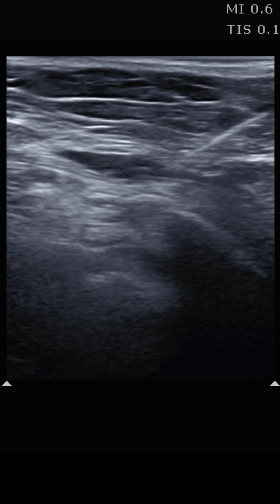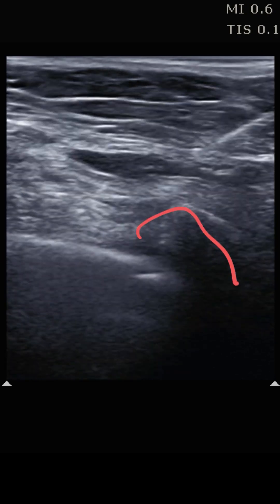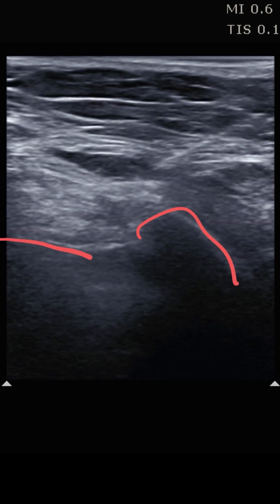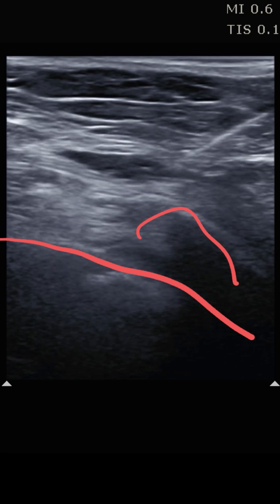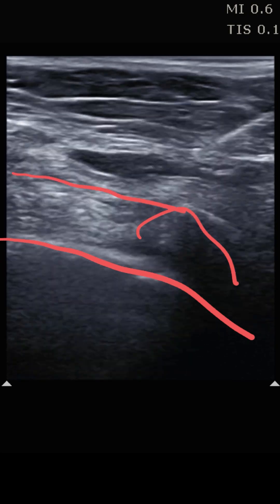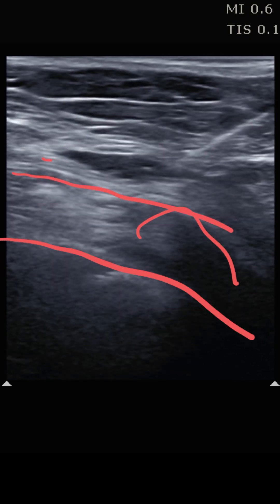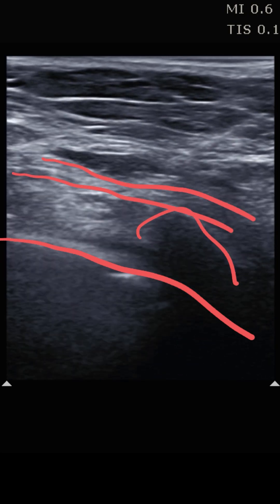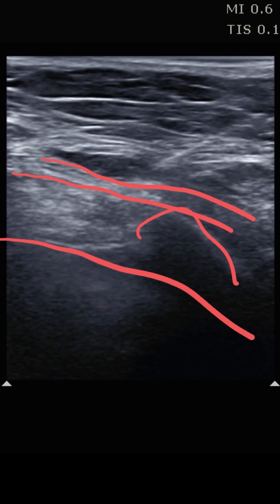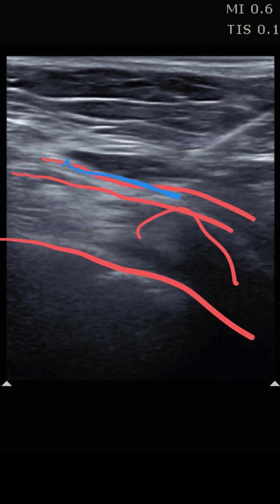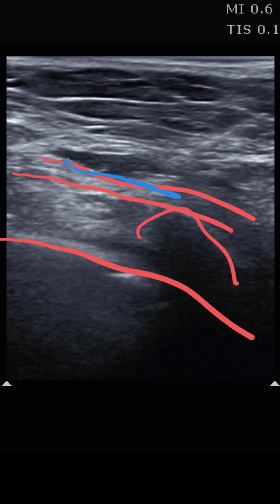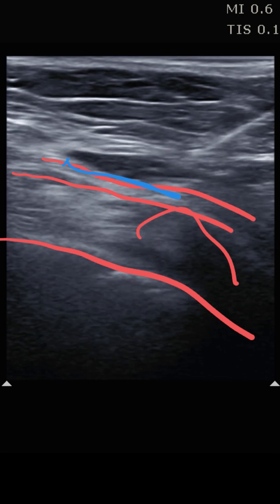Just to get our bearings, we can see a rib right there and the pleural line right there. The muscle that lies right on top of this rib is the serratus anterior muscle. We're targeting the plane that lies just above the serratus anterior — that is the place where we're going to deposit this anesthetic for this patient.